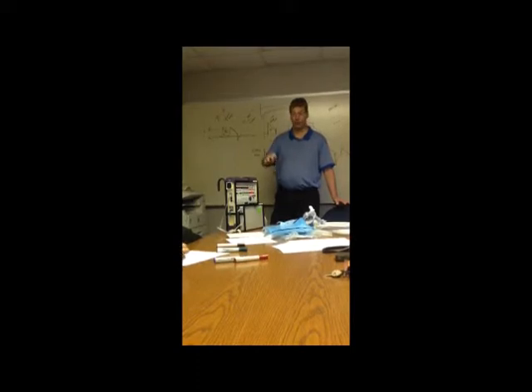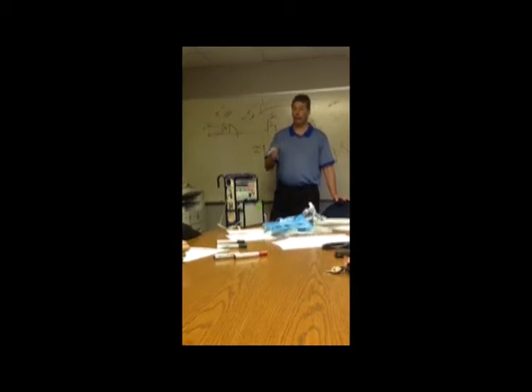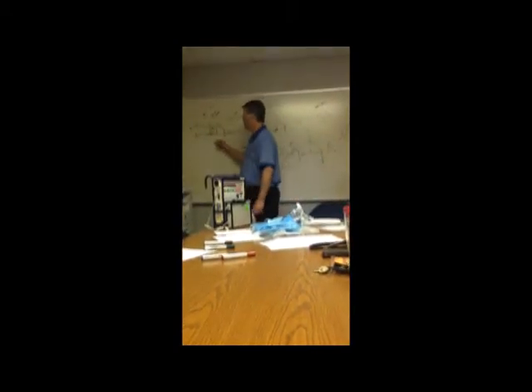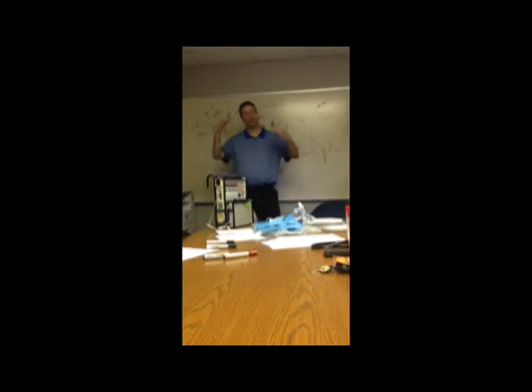So the only time y'all would ever in BiPAP adjust the EPAP, or in your case I think it's called PEEP, the setting, is oxygen. And we do, and this is what I talked about, we have a PEEP chart. If I'm going up on somebody's O2 and I get to 60, I need to have the PEEP at 8, for instance.